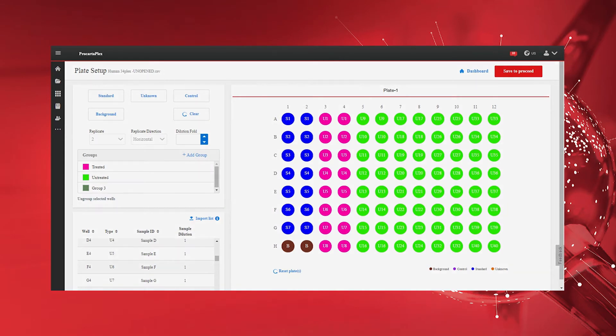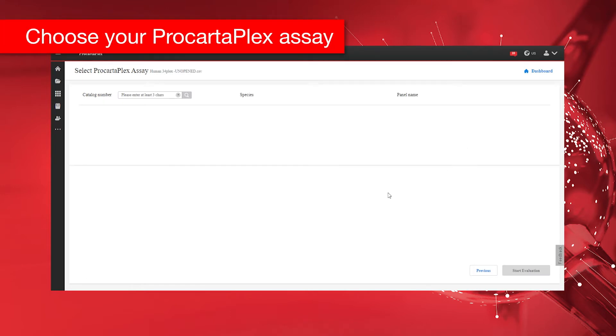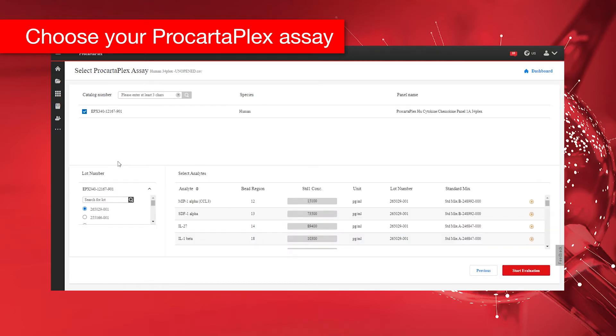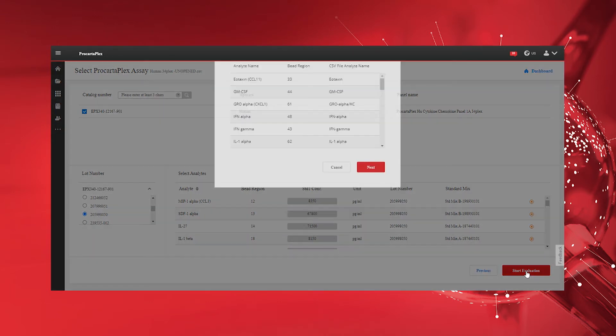After the plate setup is complete, click Save to proceed and navigate to the Select ProCartaPlex Assay page. Enter and select the catalog number and kit lot number of your ProCartaPlex Assay you want to analyze. Click Start Evaluation to proceed.